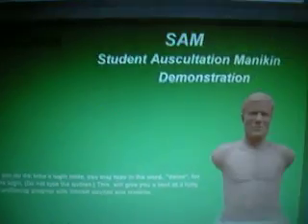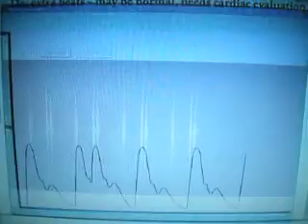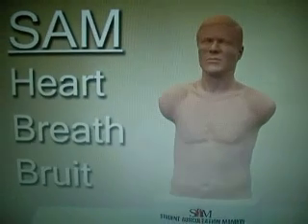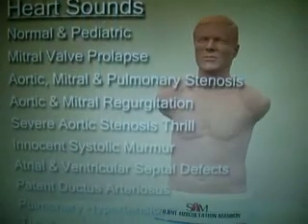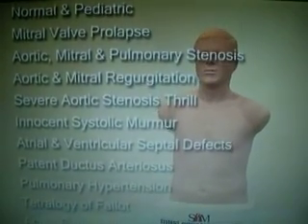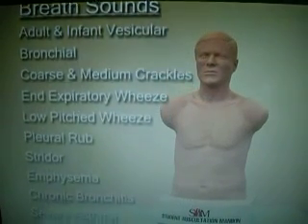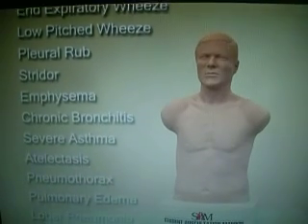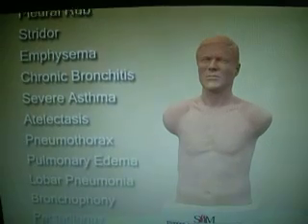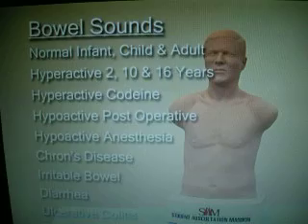3 new enhancements expand this skill: SAM Online, SAM View for visual display of sounds, and the Pulse Training System. SAM presents heart, breath, bruit, and bowel sounds at the correct anatomical site. SAM has more than 33 heart sounds, complete with the ability to palpate a murmur or thrill. There are 21 breath sounds, including egophony, bronchophony, wheezes, crackles, pneumothorax, emphysema, pneumonia, asthma, etc. More than 20 bowel sounds can be heard in the upper right and left abdominal quadrants.